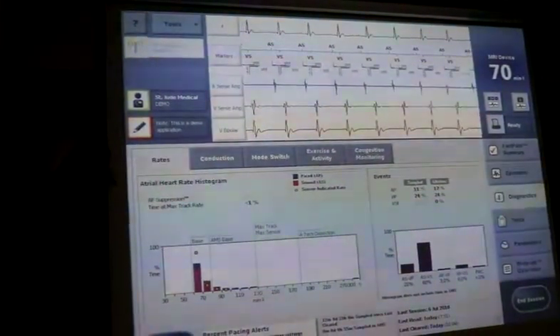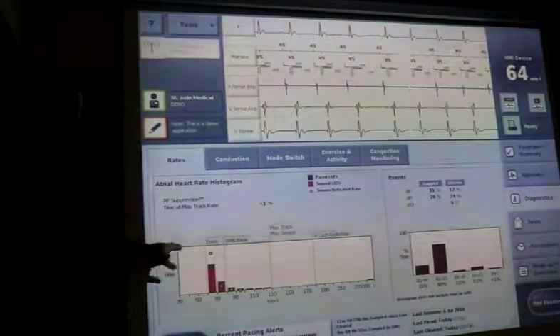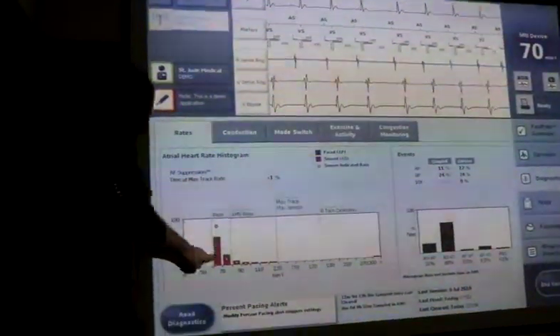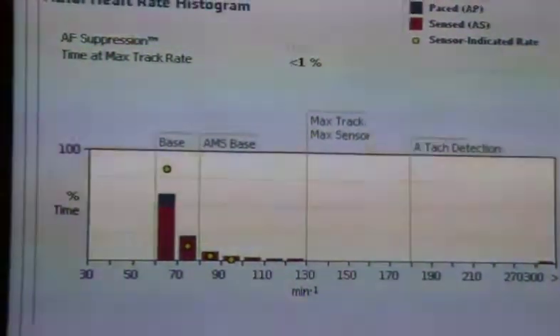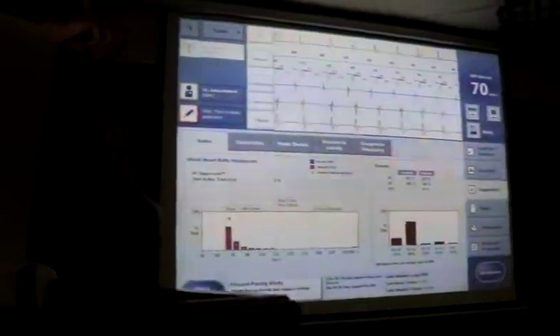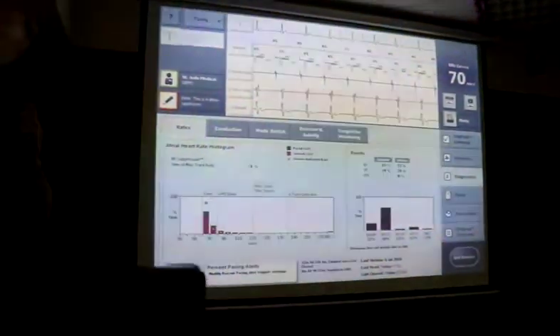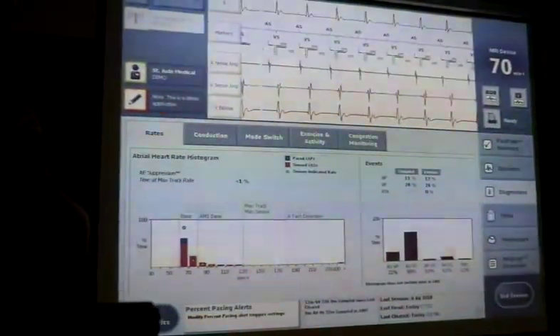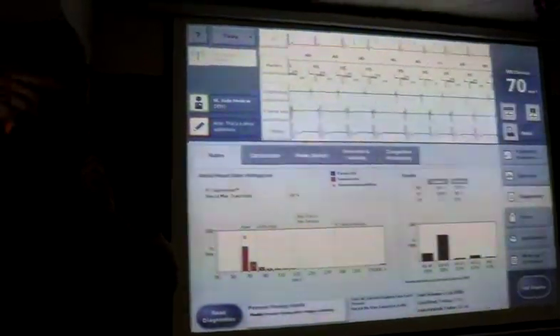If they are 90–95% of the time in the lower heart rate bracket, so let's say we program it from 60 beats per minute to whatever, they may well have sinus node disease, and you might want to consider that, because rate response can help, okay? Rate response, they can walk, the accelerometer picks up, the heart rate goes up, okay?